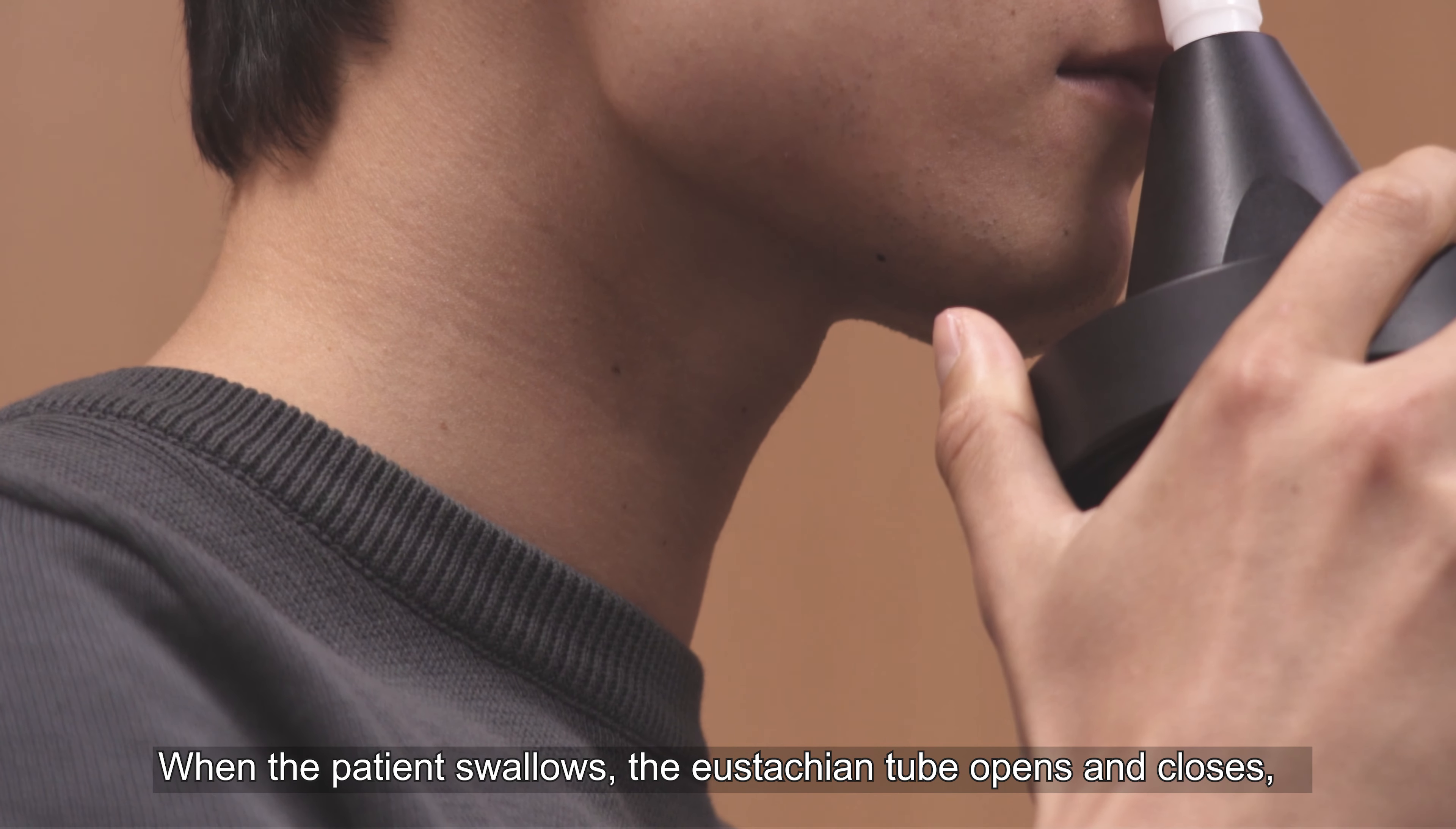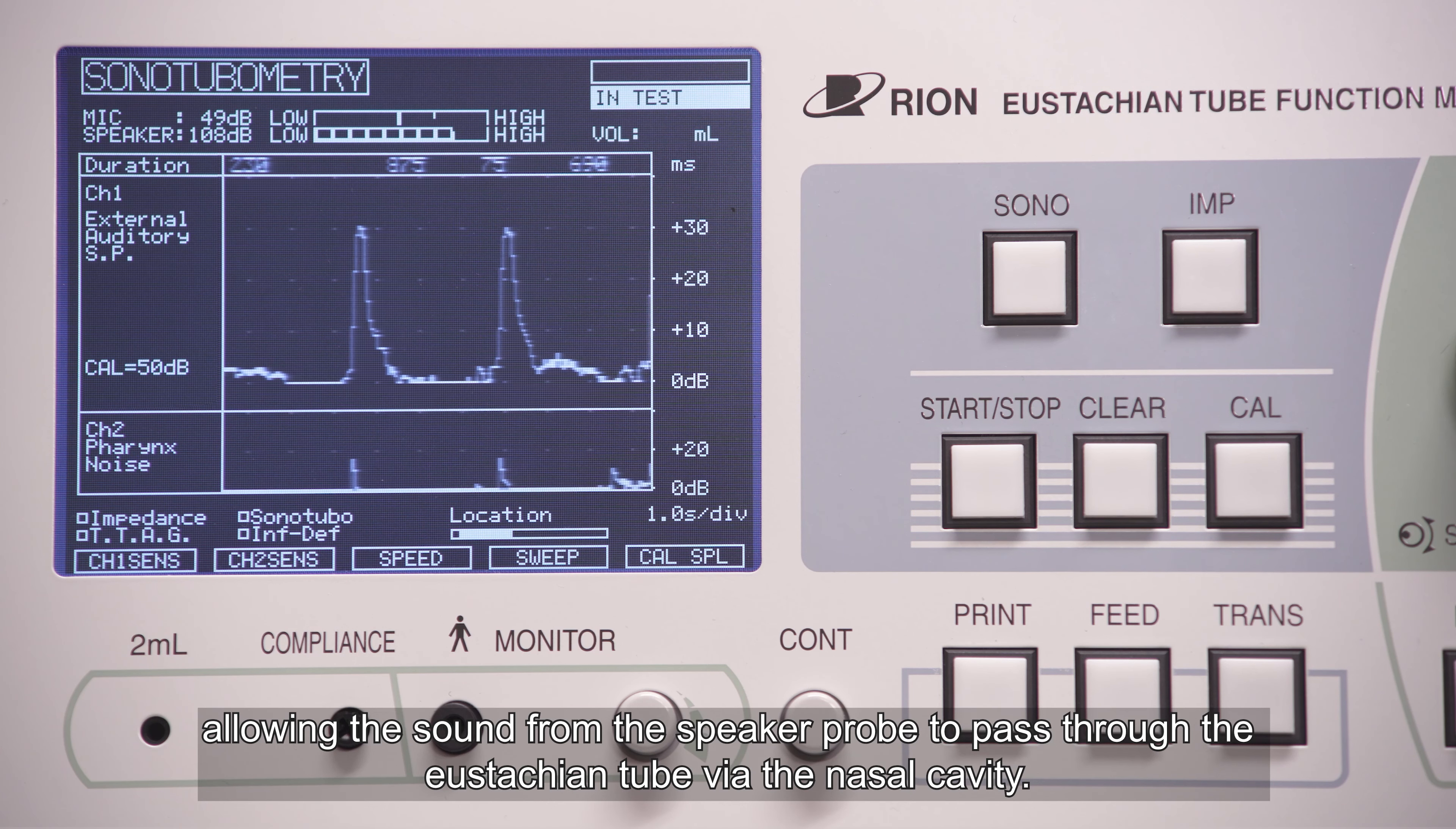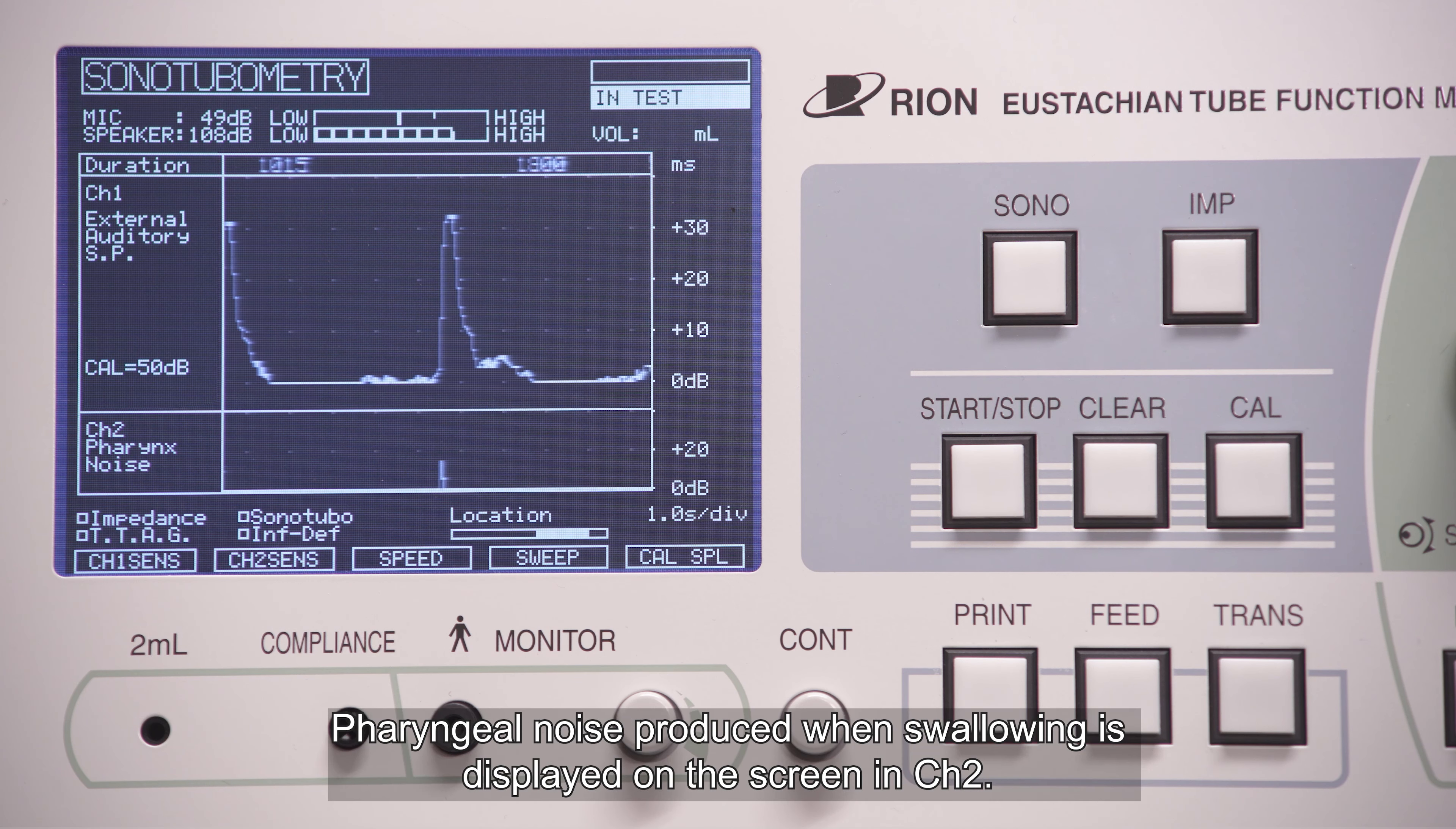When the patient swallows, the eustachian tube opens and closes, allowing sound from the speaker probe to pass through the eustachian tube via the nasal cavity. This sound is detected as a pressure level by the sonotubometry probe's microphone and is displayed on the screen in channel 1. Pharyngeal noise produced when swallowing is displayed on the screen in channel 2.